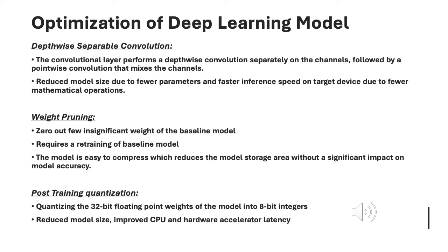The baseline model of the proposed autoencoder is trained on a desktop. A standard deep learning model trained on a desktop or a server needs significant optimization in order to efficiently run on a low power edge device. In our application, we select Raspberry Pi 3 model B+ as the target edge device to run the denoising application. The following steps of optimizations are applied to compress the baseline model.